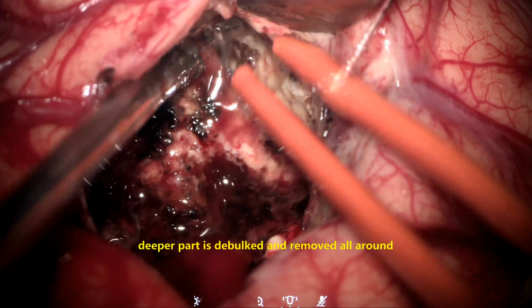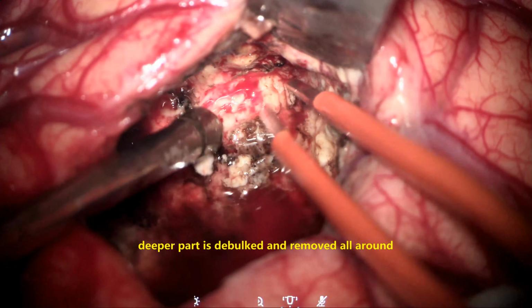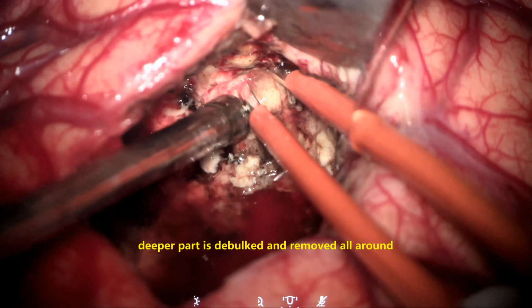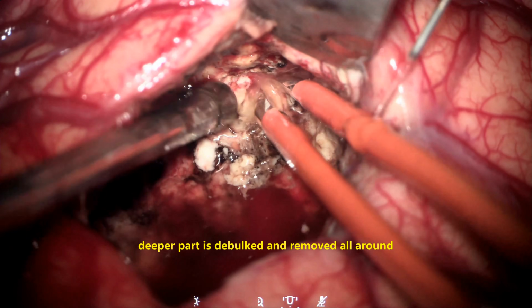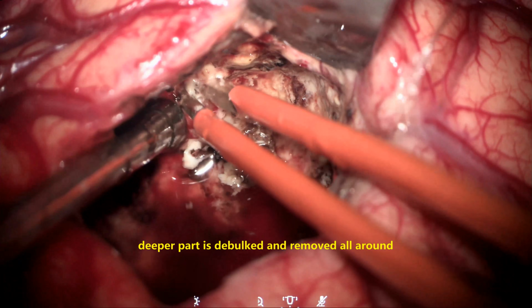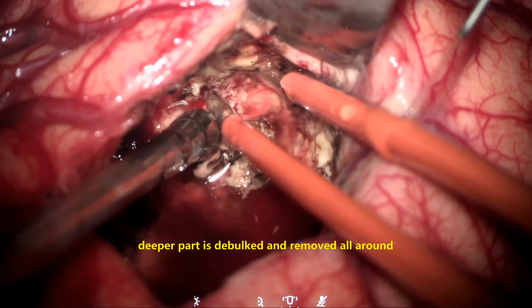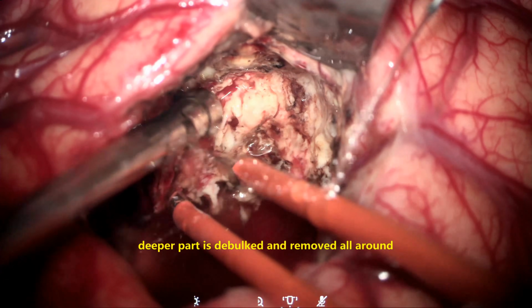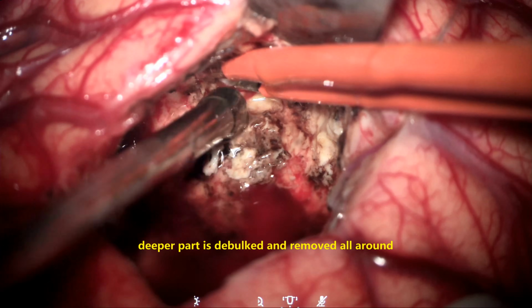Sometimes during the dissection, the blood vessels retract into the brain parenchyma. Post-operatively, due to the increase in blood pressure, they start bleeding and cause post-operative hemorrhage. This fact needs to be kept in mind, and accordingly we need to increase the blood pressure before we decide to close.